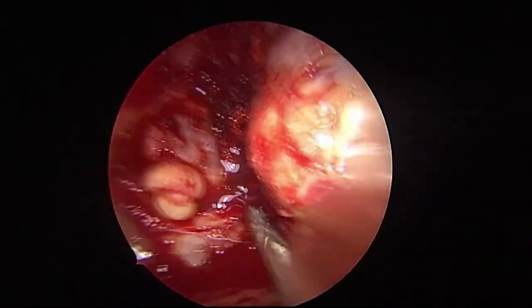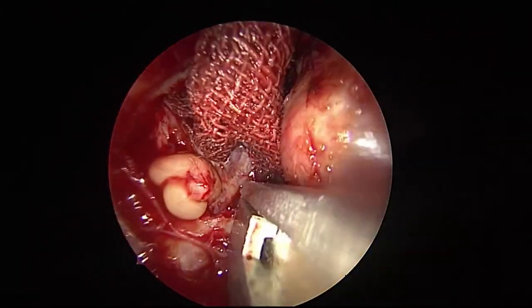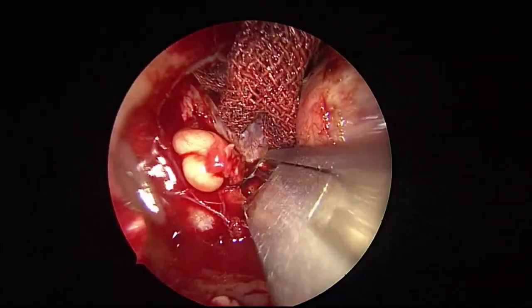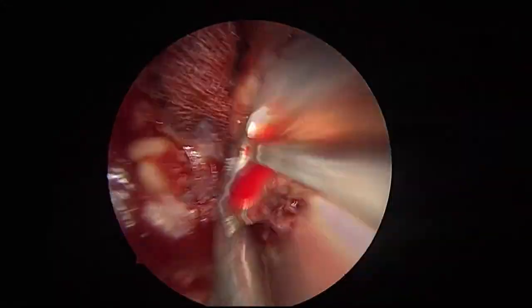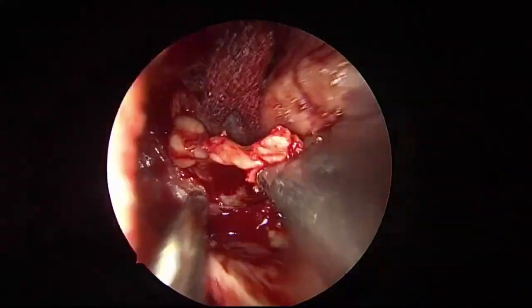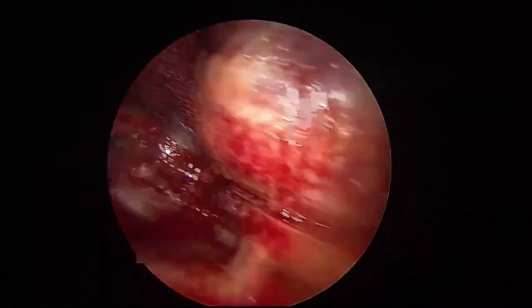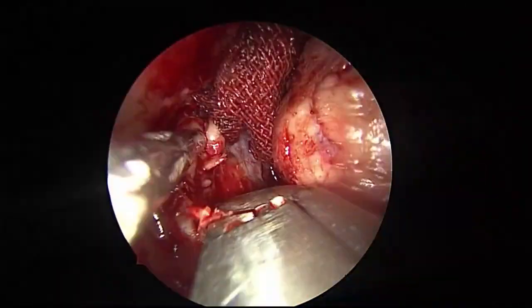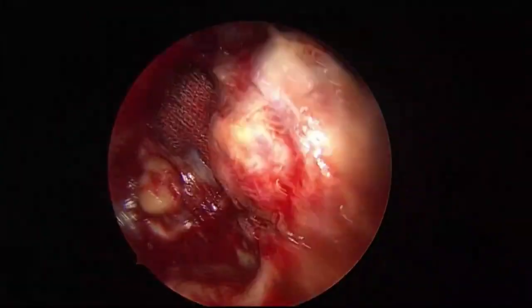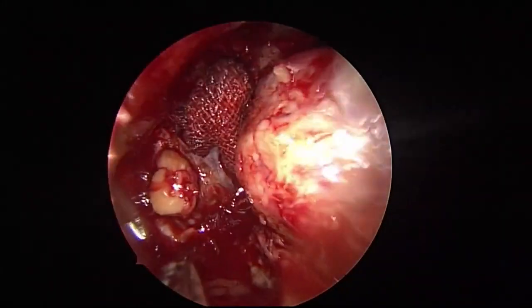Yes, sir. I'm exposing more and more. That's the infratemporal fossa fat.